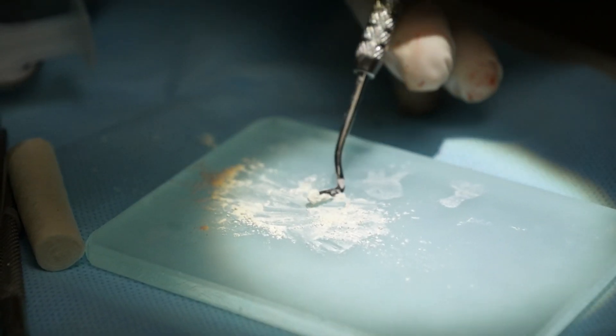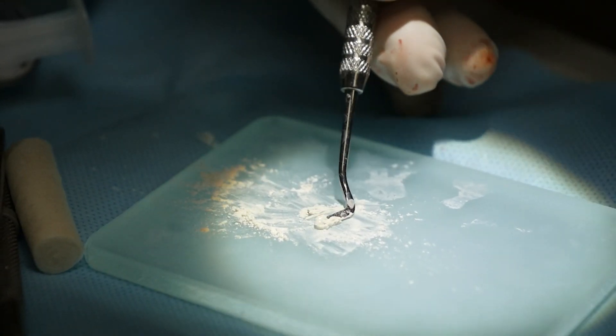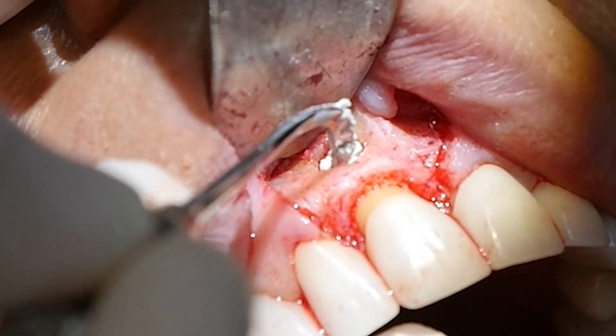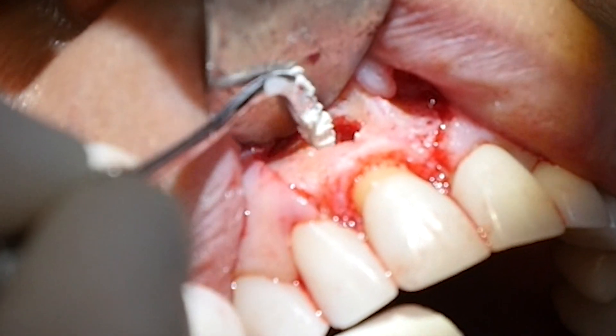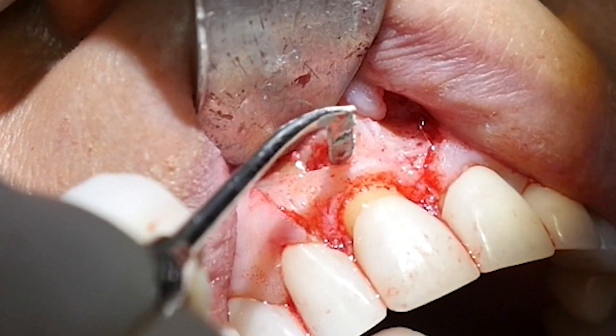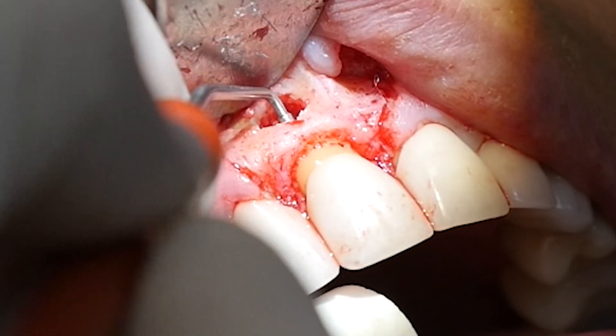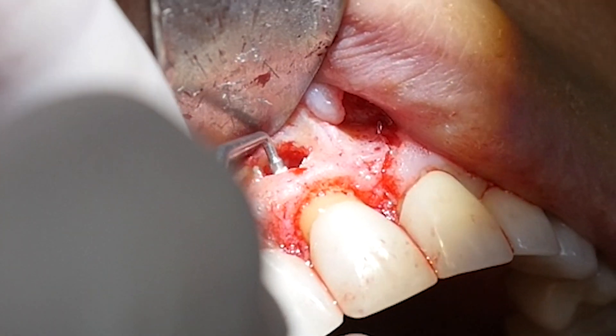A trough is prepared at the end of the root, which is sealed with MTA, short for mineral trioxide aggregate. This is an extremely biocompatible material. In the old days, amalgam was used, which was, well, disastrous.